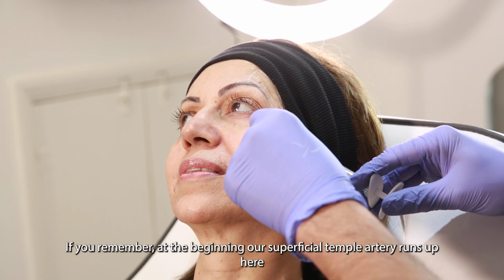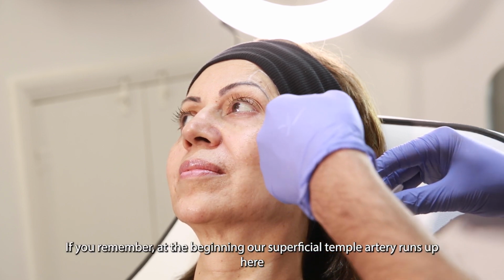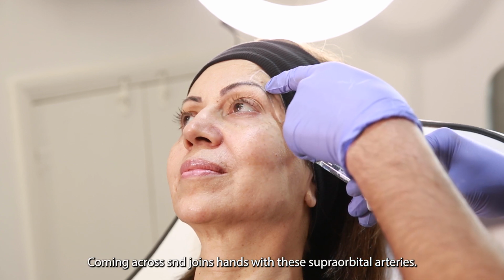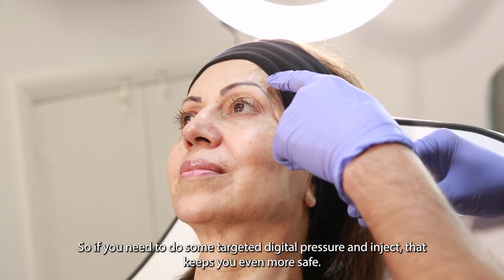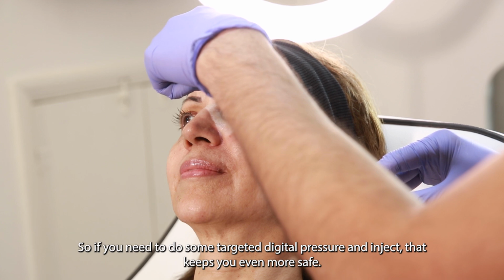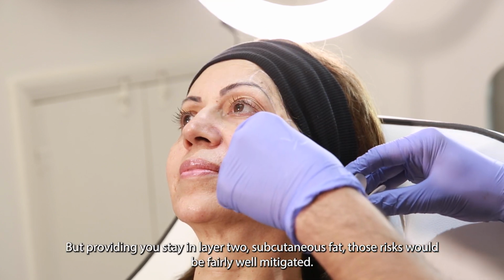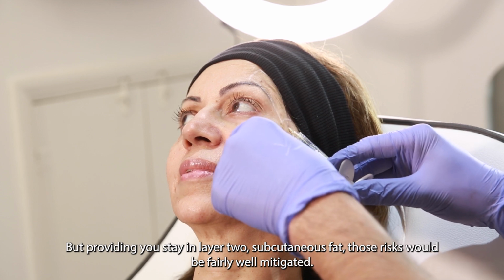If you remember at the beginning, our superficial temple artery runs up here, coming across and joins hands with the supraorbital artery. So this is really your highest risk area. So if you wanted to do some targeted digital pressure and inject, that keeps you even more safe. But providing you stay in layer 2, the subcutaneous fat, those risks should be fairly well mitigated.